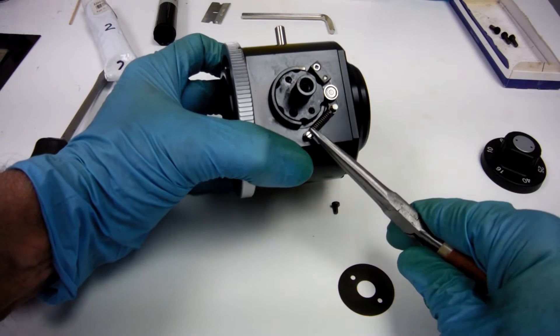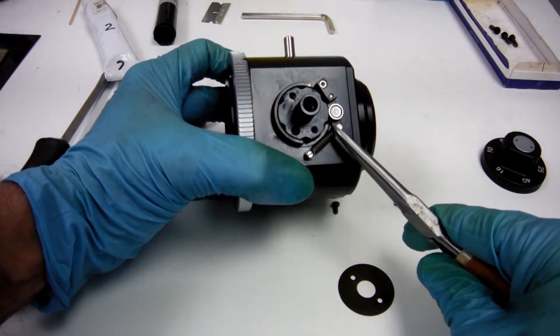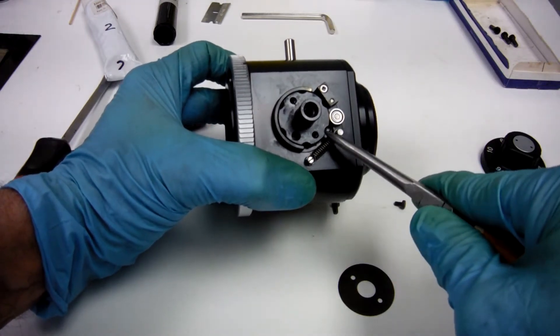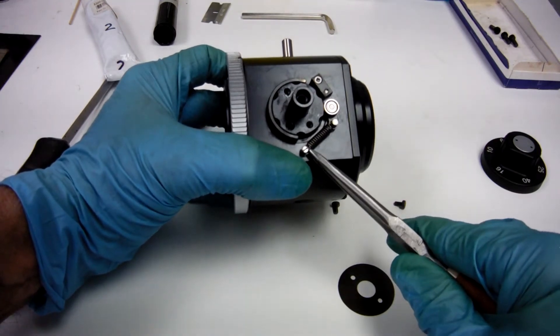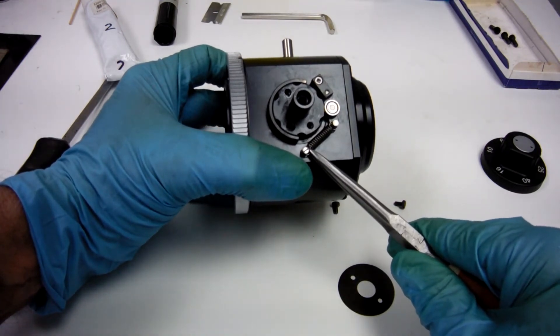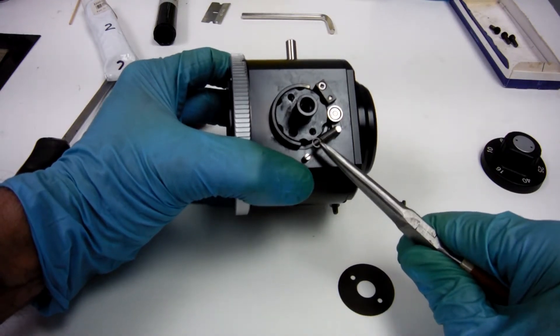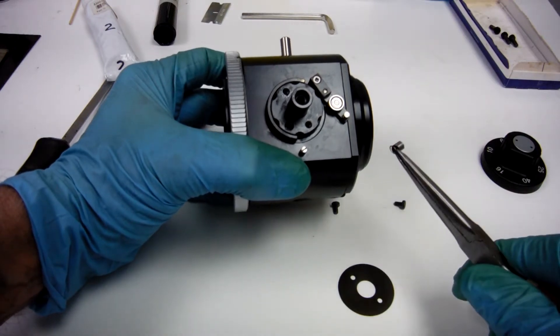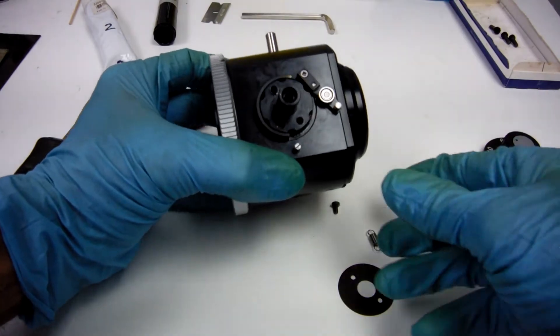You have a spring here that holds this bearing. The bearing goes into these notches that are on the end of this barrel. We'll take the spring off. Be careful. It might want to travel. Got that? Put that out of the way.